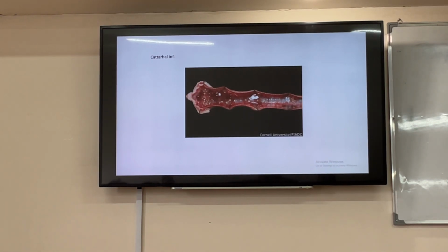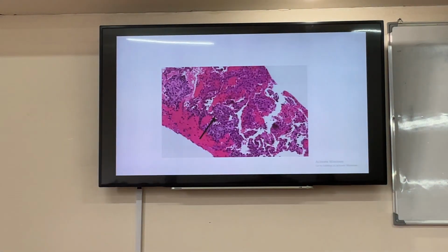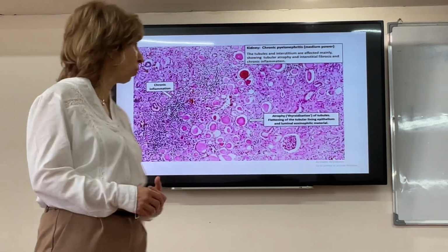Now, what is catarrh? Excess mucus. Because I have mucus, it's acute inflammation, but with excess mucus production. Some sort of serous, acute, but the production of mucus is exaggerated because I have mucus lining. This is hemorrhagic. What is it? It's easy. Bleeding. Any acute inflammation where I see all this bleeding, I say it is hemorrhagic. These are easy. Okay? Till here it's okay with acute inflammation?